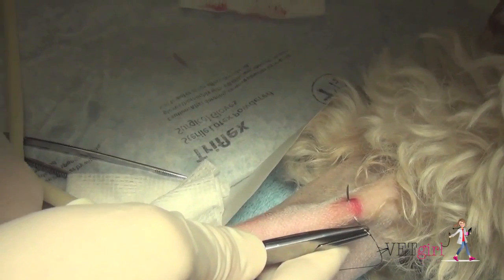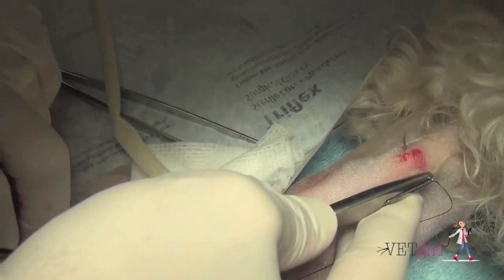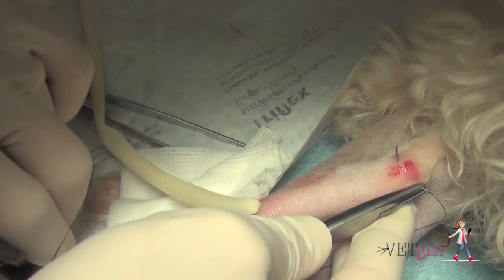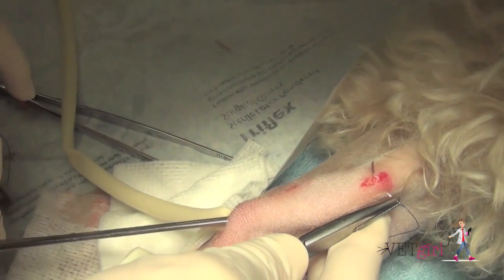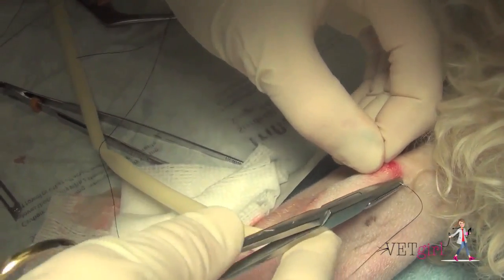Here you can see that we're placing a Penrose drain, placing it in so it creates basically a tunneling or opening so that the pus can drain out. We're making sure to tack down the drain using a blind tack suture technique. The most important thing is that we do want to tug and manipulate the drain to make sure it's secured with the suture.